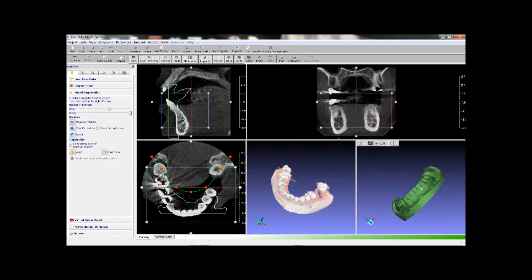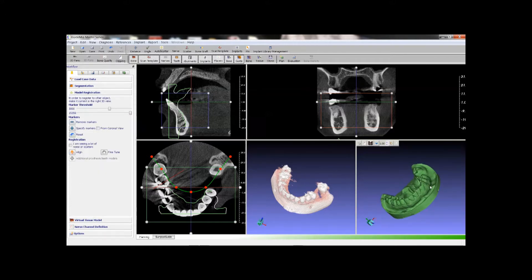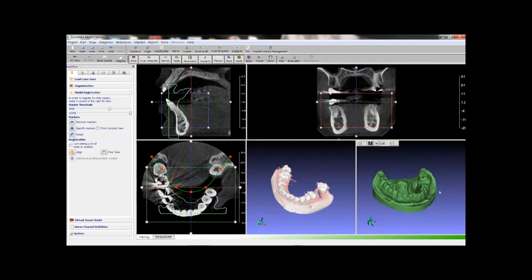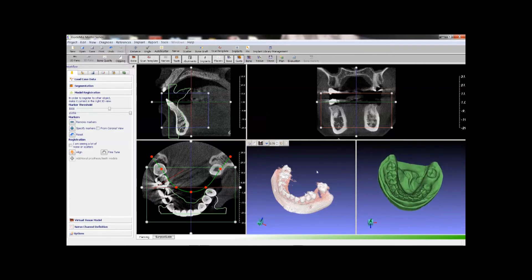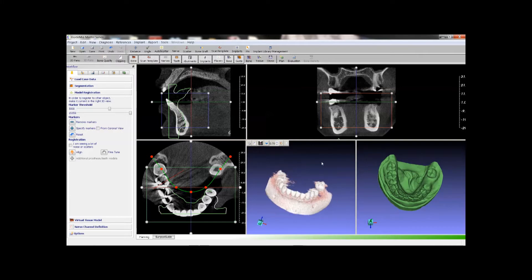Next we will superimpose the stone model over the patient CT scan. First we rotate the views so that we can see both scans in the same direction.